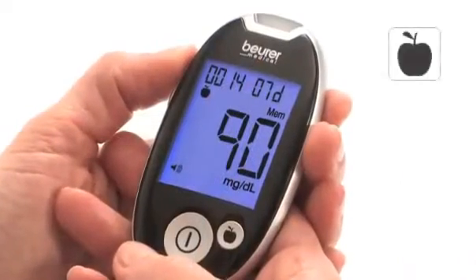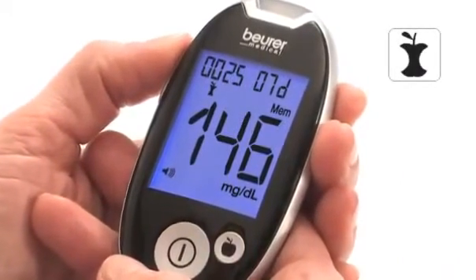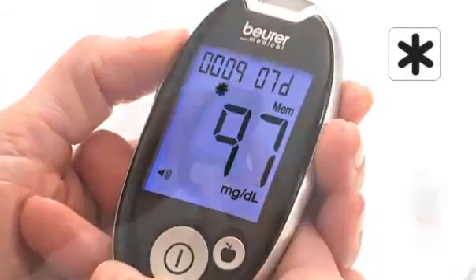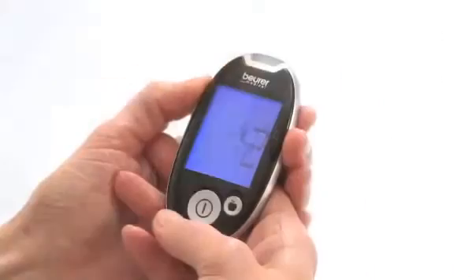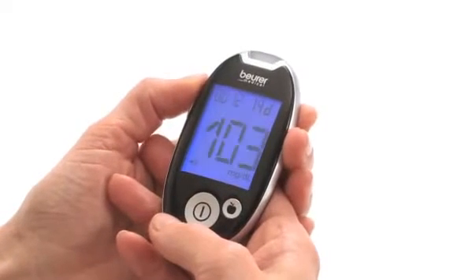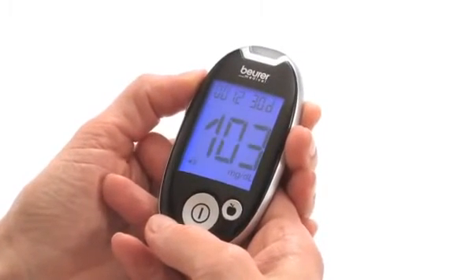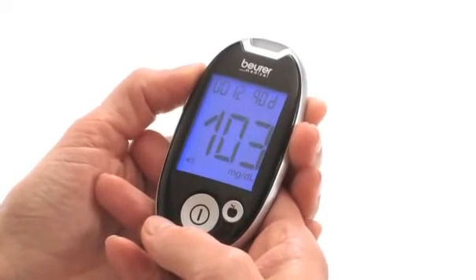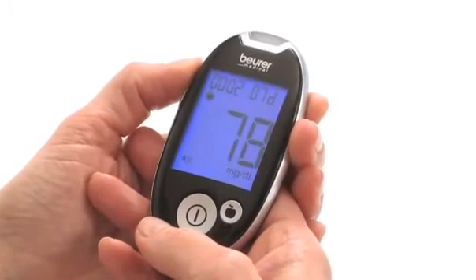The simple measurement marking for values before eating, after eating, or in general enables optimized management of diabetes. From the 480 saved values, the average blood glucose value can be calculated for 7, 14, 30, or 90 days for all measured values and unmarked values.